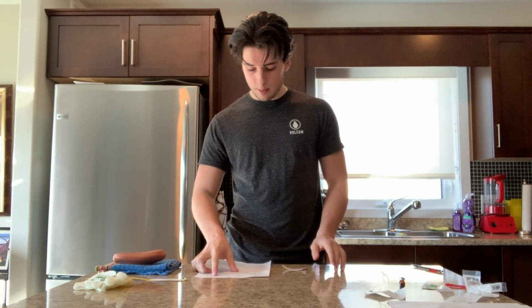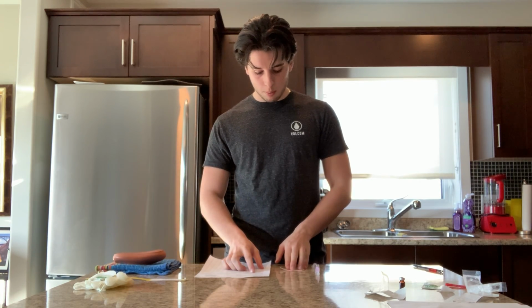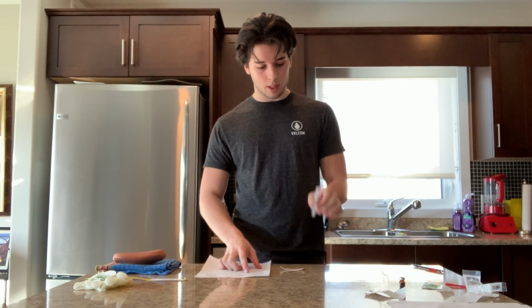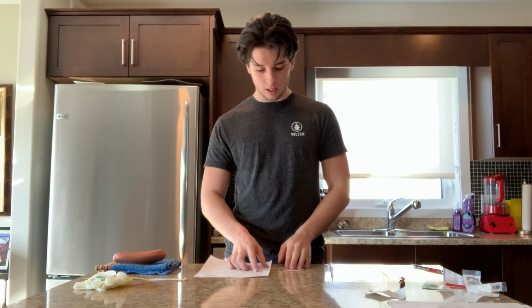So I'm going to look at their name first, Jake Nursing, JN, and then the medication we are giving is metoclopramide, and dose 5 milligrams in 1 ml. So we can check that we are still 1 ml in our syringe, which we do. And after the dosage, it's to be given subcutaneously.